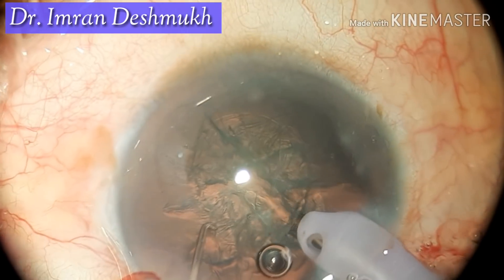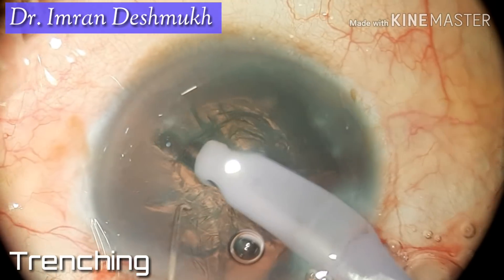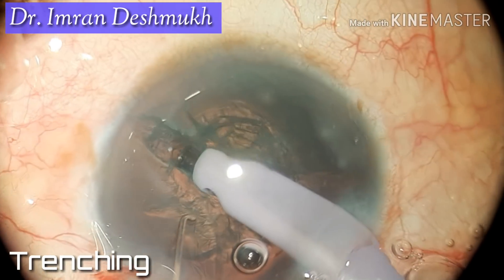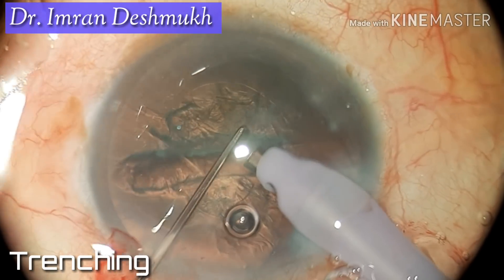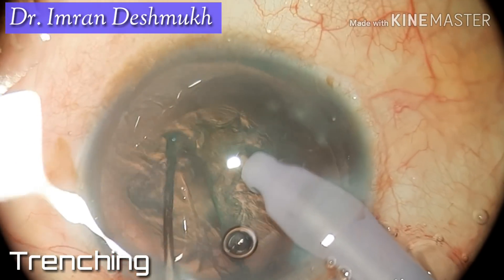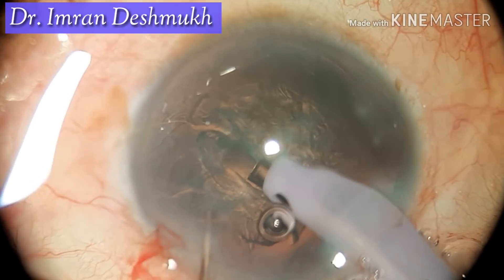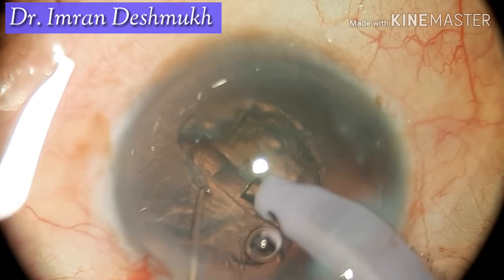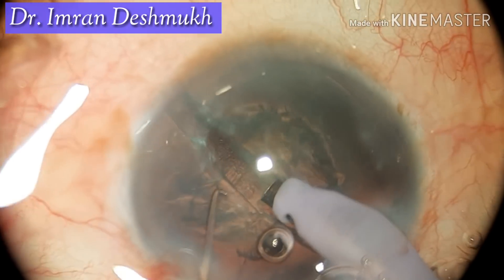Start trenching, but be very careful while trenching because the nucleus is very soft. You don't want to go too deep, and you don't want to be too superficial, as that might hamper your divide. As you have seen, I've trenched one half — now start trenching the remaining half.